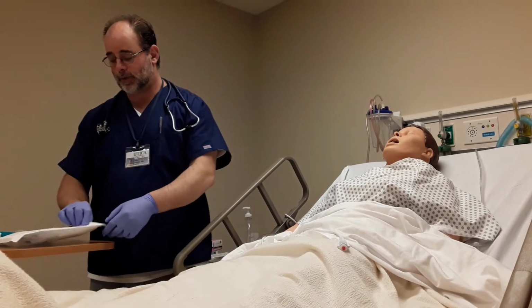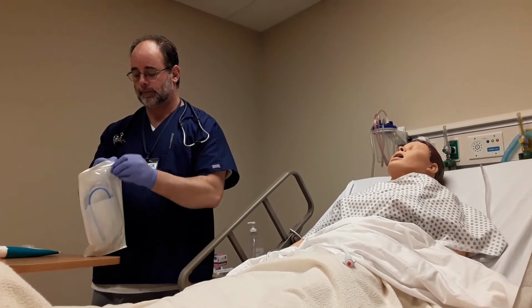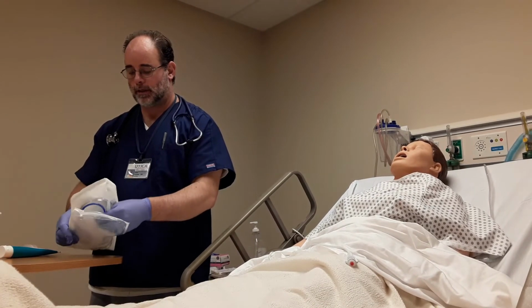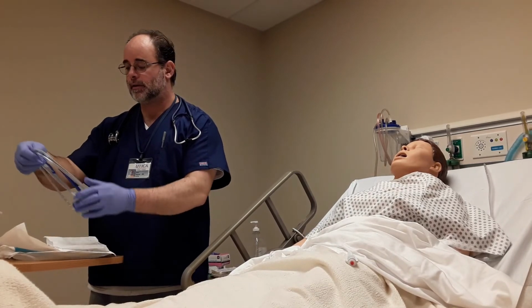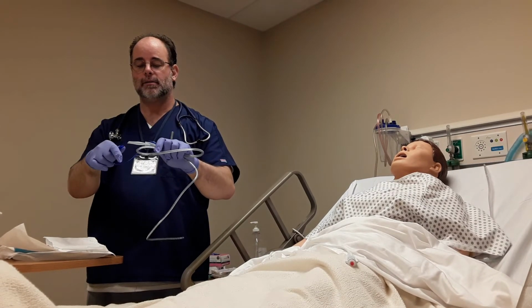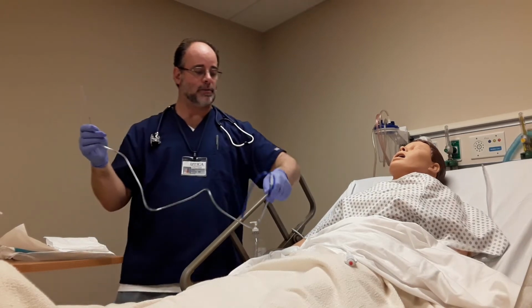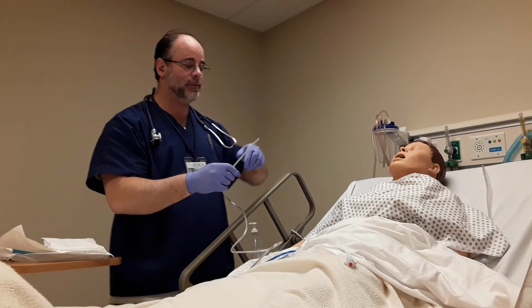Okay. So at this point, I'll open up my equipment. I notice that it's a brand new setup here, and we have a connection piece there, which is important because we always seem to lose those. It's important to make sure that we maintain that for obvious reasons, which I'll explain a little bit later.